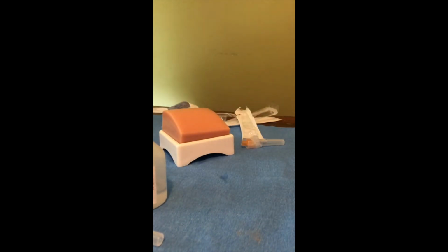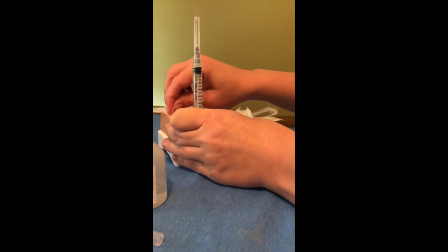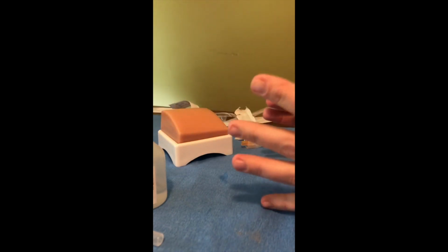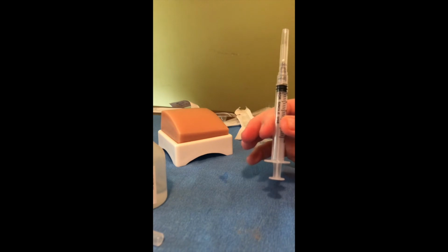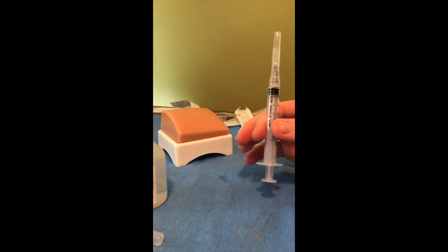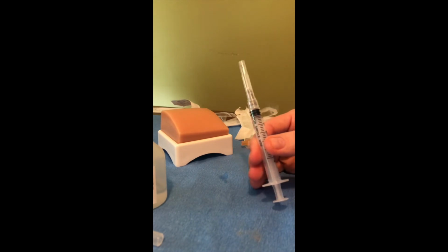Set that this side till it air dries. We're going to cleanse our skin. Now we're going to pretend this is the back of someone's arm. Right above the elbow, going up. You're going to pinch at least 1.5 to 2 inches of skin.